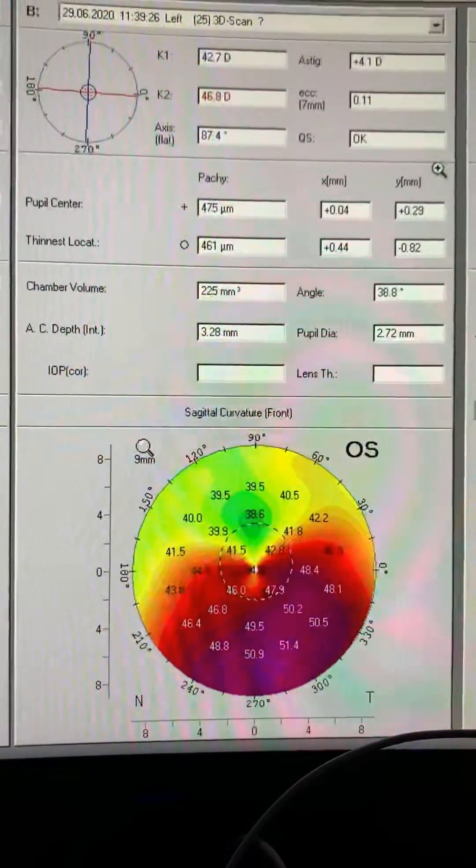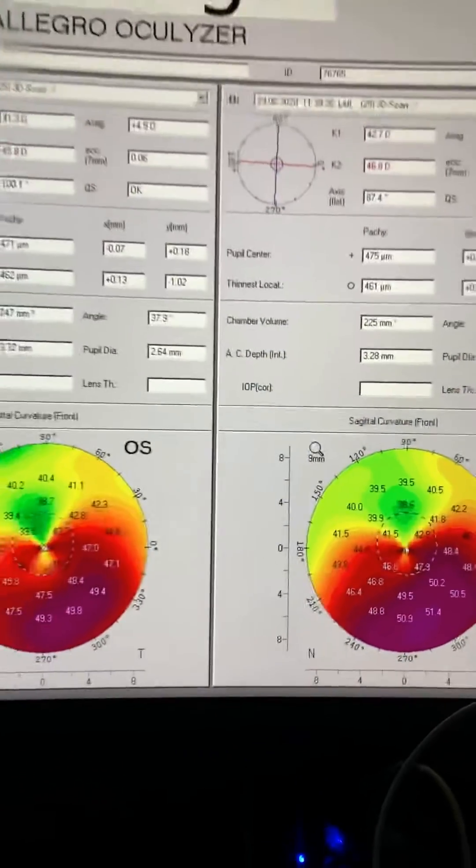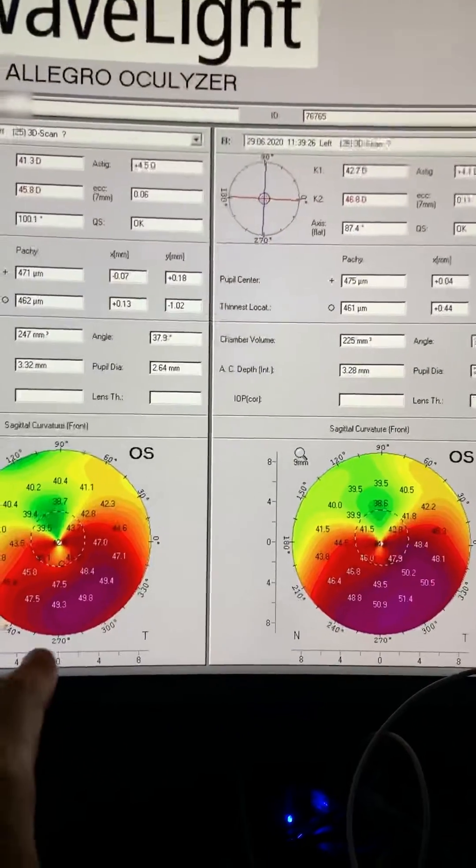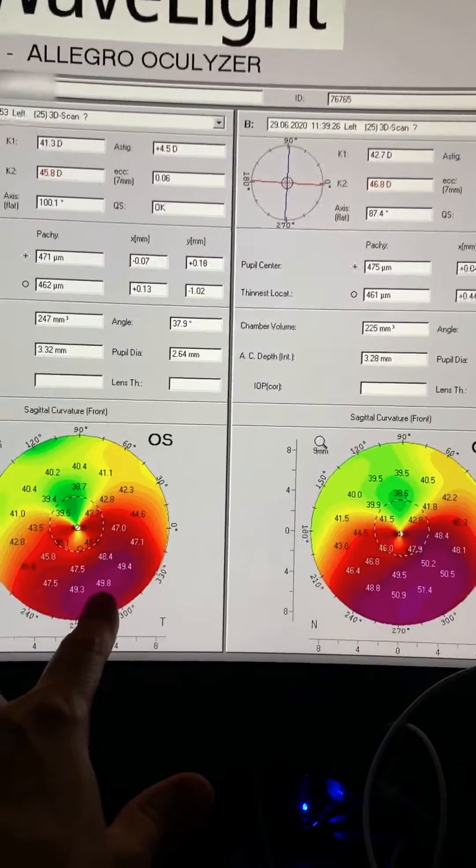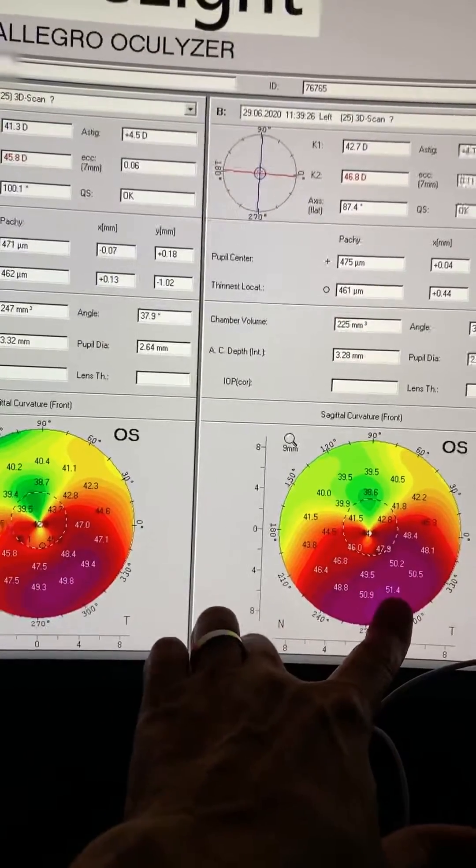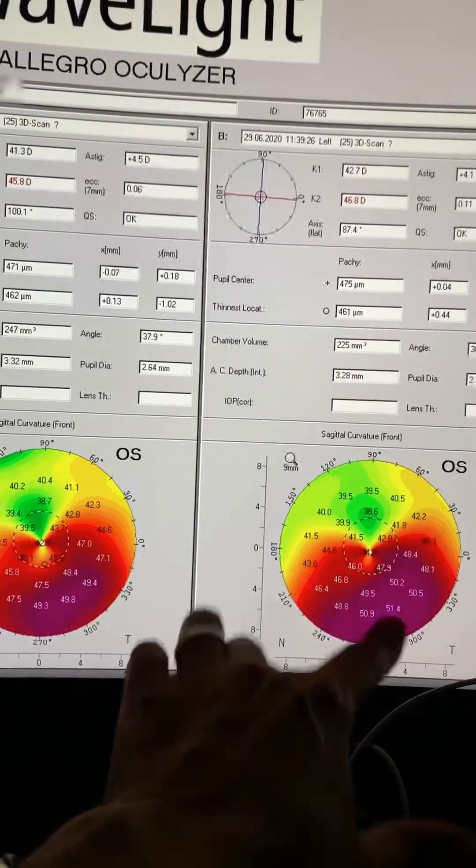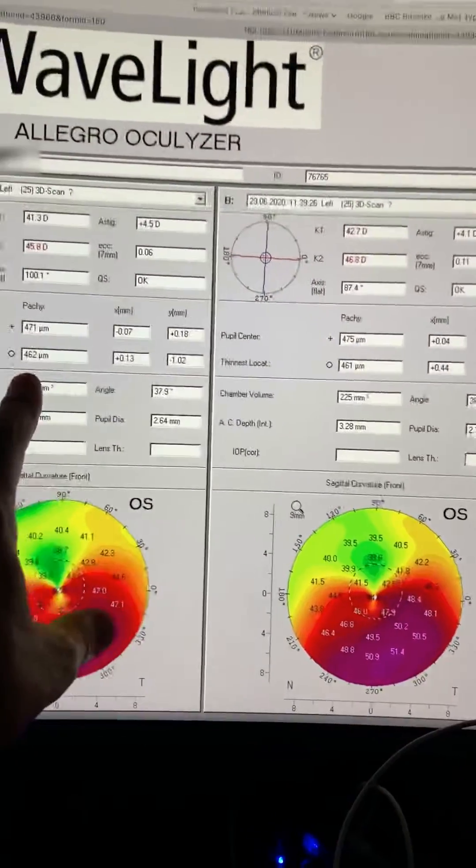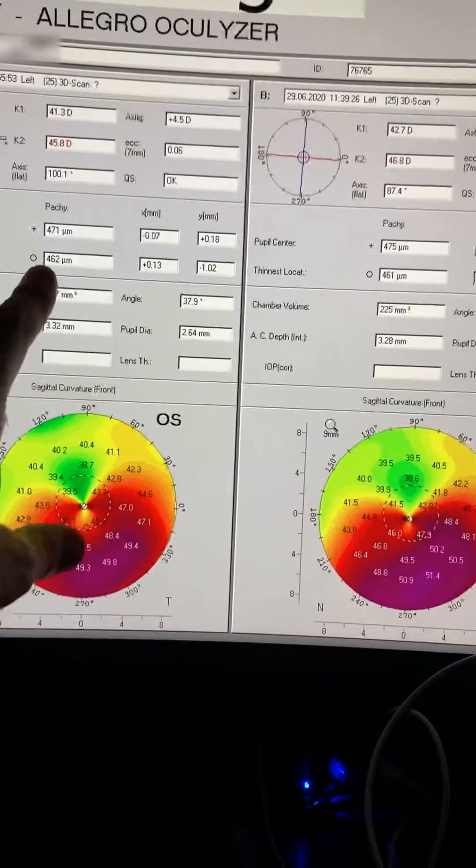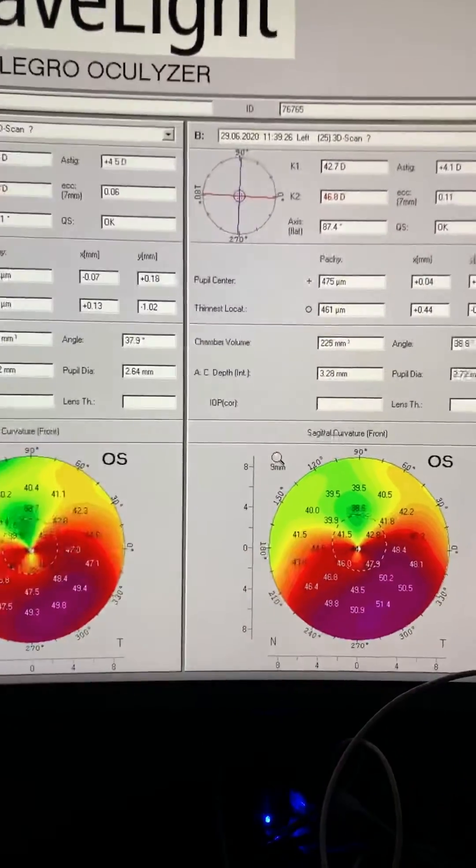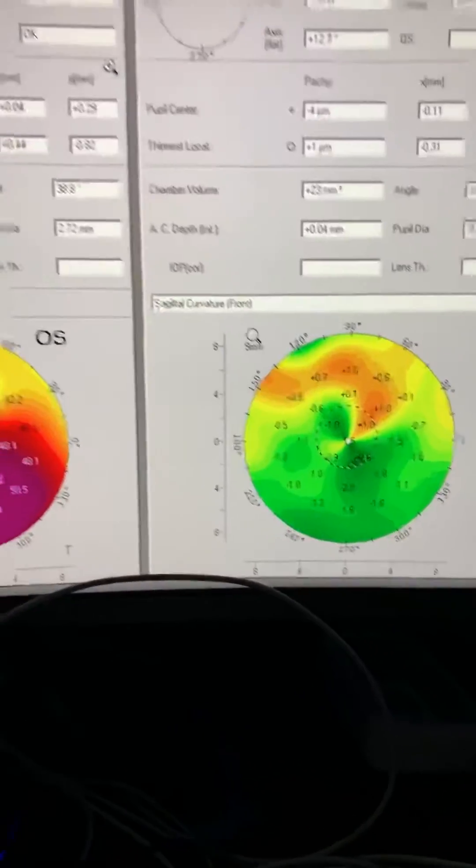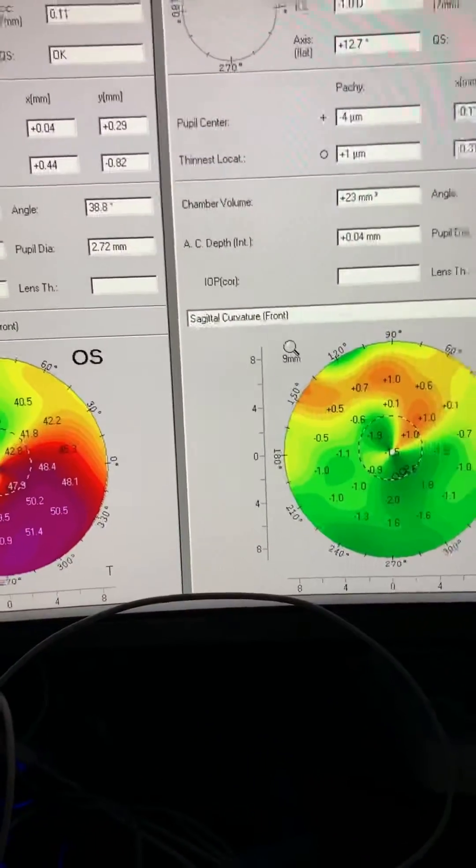You can see that the steepest K has progressed from 49.8 to 51.4. The thickness does not show a significant change, 462 to 461. And the change is about two diopters, a very significant change.